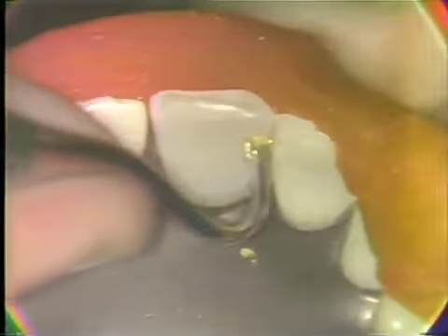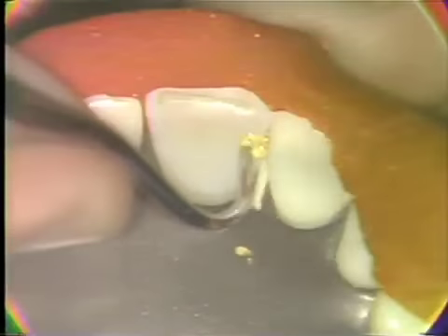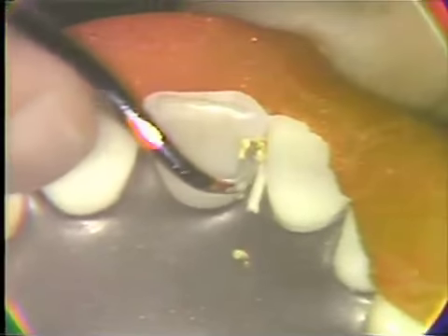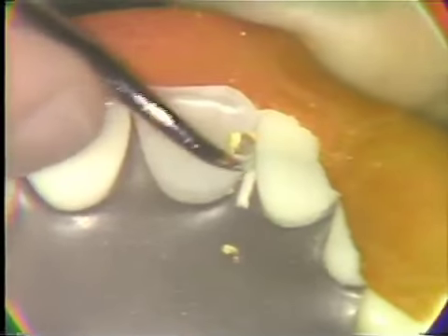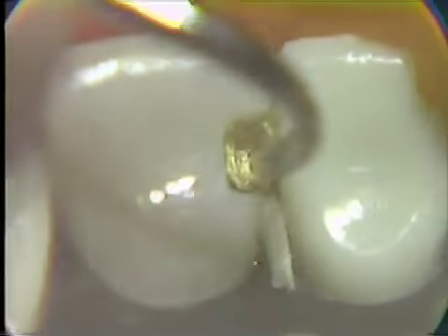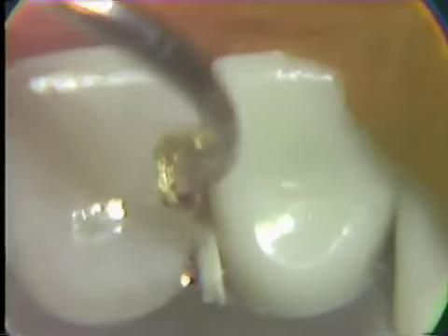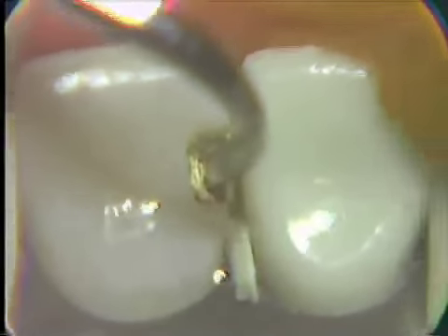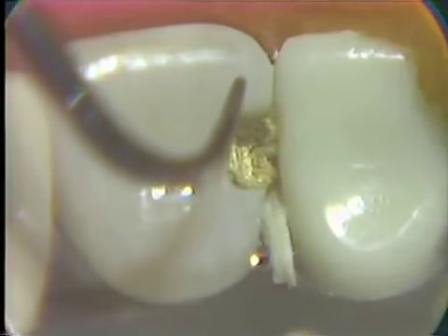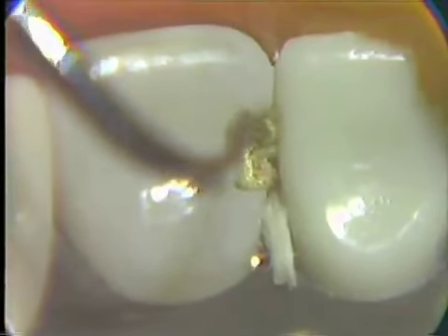Again, considering then the stepwise nature of the condensation, overlapping each successive area. We'll move around now to the opposite end of that condensing instrument and making sure that, as this extends on out to that labial wall and labial margin area, we condense into that position. So we're locked then in three areas. Principally the retention in the lingual cervical and incisal area and across to the labial cervical area.